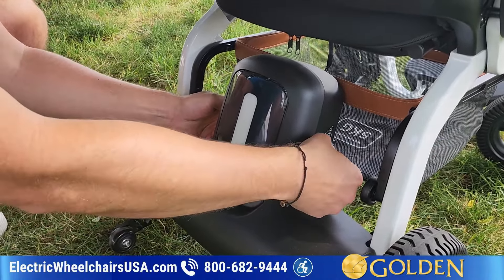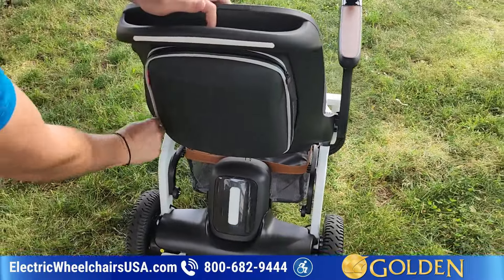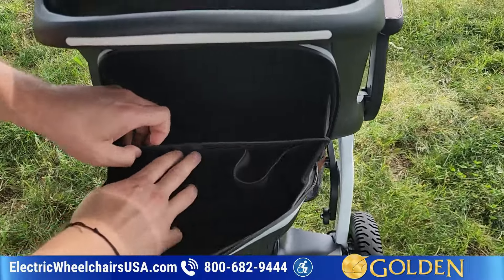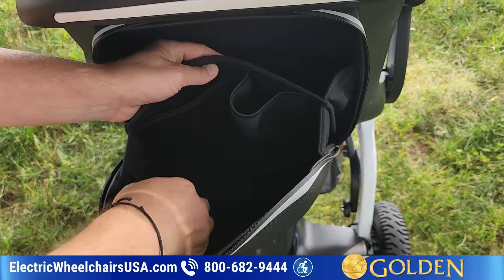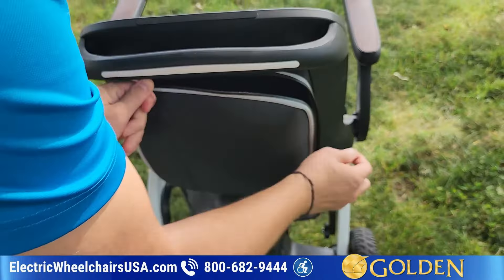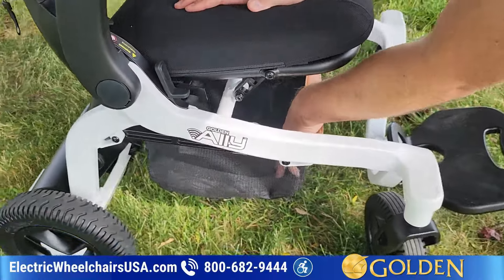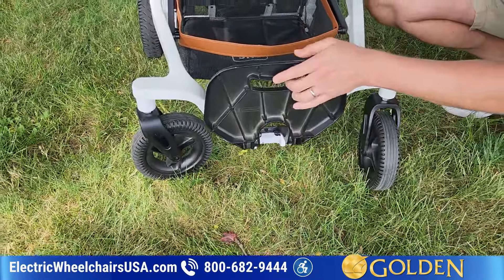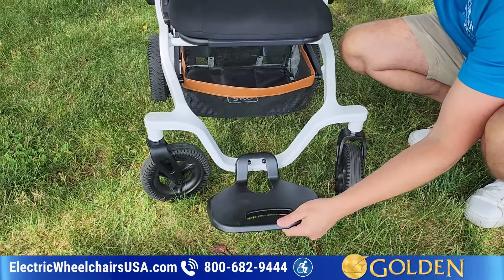Now I have it back in, so it's in the lock position. This is a hard shell storage compartment, which is pretty nice. You can see there are a few pockets in here — you could put a laptop in here if you wanted to. There is also additional storage underneath the seat — a storage basket where you can put some items as well. The foot plate also flips up when you fold it.